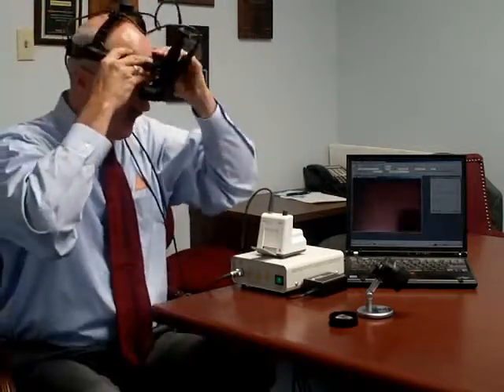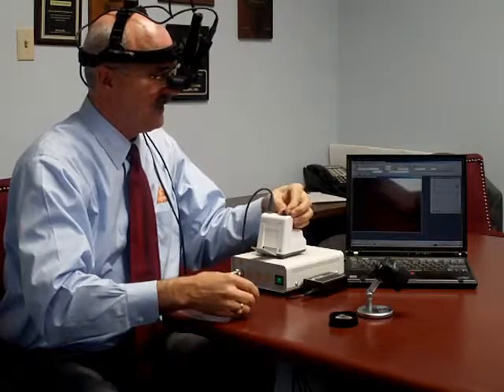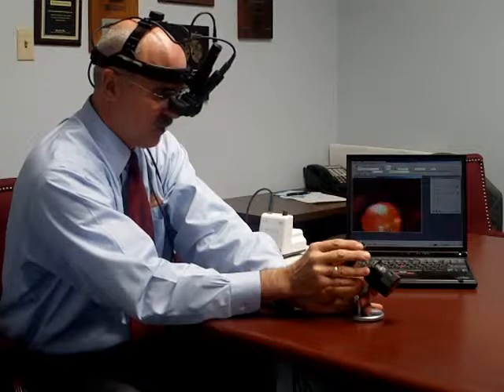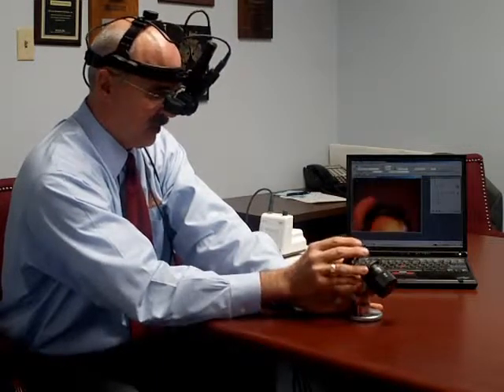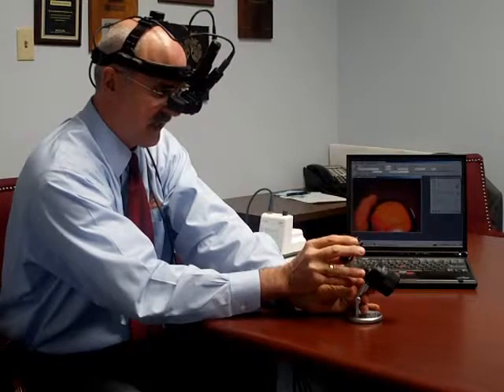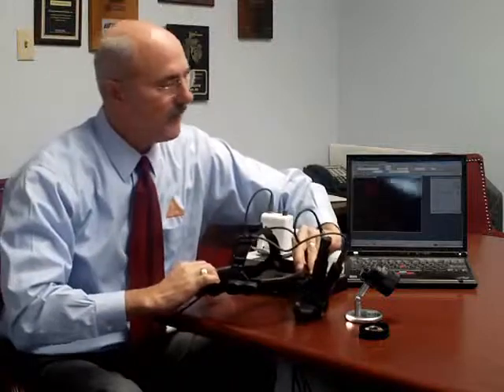By putting the instrument on in a manner typical to any indirect and turning the light up to a modest level, you do the exam just as you would any indirect ophthalmoscopy exam — looking throughout the periphery, posterior pole, and all of the various landmarks that you are accustomed to seeing. The video images are displayed on the computer or on a TV monitor connected to a VCR. Any method of display that you choose is adaptable to the Heine Video Omega 2C.